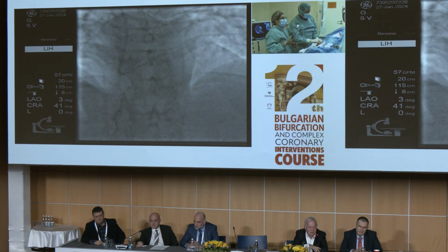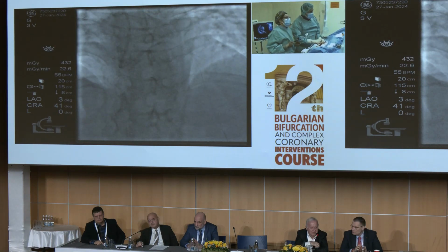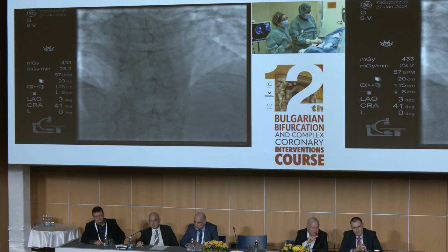We'll do a short inflation more. Go back. One more. Open the door. Close the window. Push your balloon again.